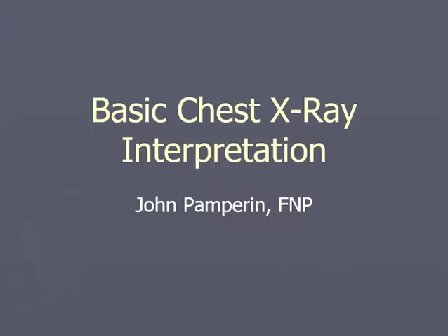Okay, I'm going to talk today about basic chest x-ray interpretation. To give you a little background, the first 5 years of working as a nurse practitioner, I worked in a pulmonology office, so I read at least 10 to 20 chest x-rays a day, and the more you do it, the better you get. So let me just show you a few of the tricks and tips that I've learned over the years.